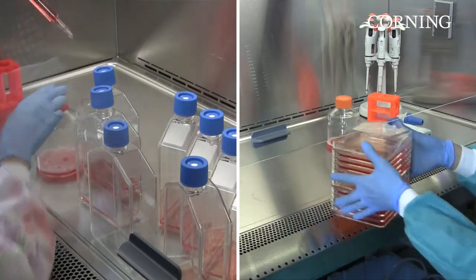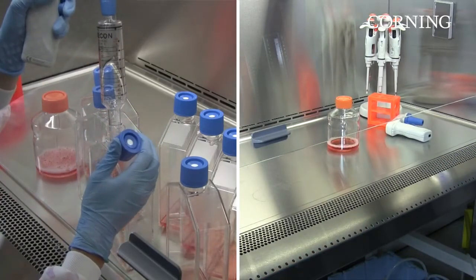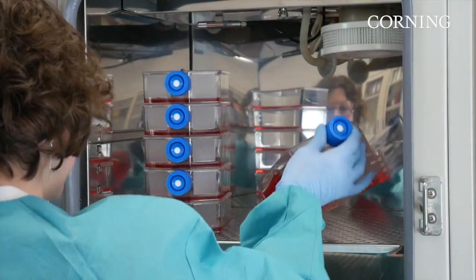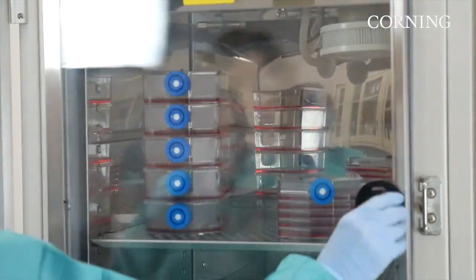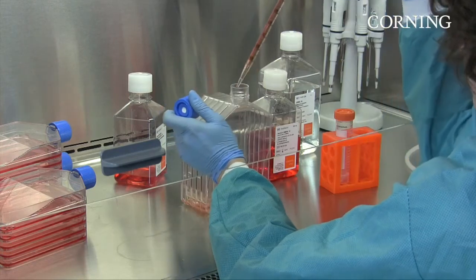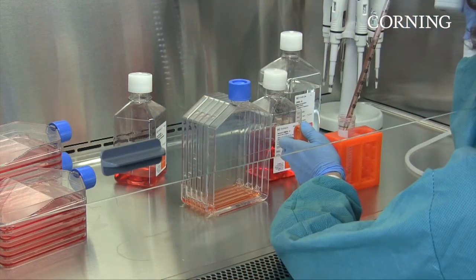The Multiflask is now ready for incubation, while the single-layer flasks are still being seeded. A Falcon Multiflask takes up far less incubator space than an equivalent number of single-layer flasks, which means you can incubate more cells in less space. By decreasing the number of vessels you have to work with, the Falcon Multiflask also streamlines your cell harvest.